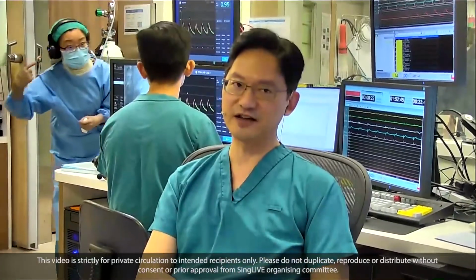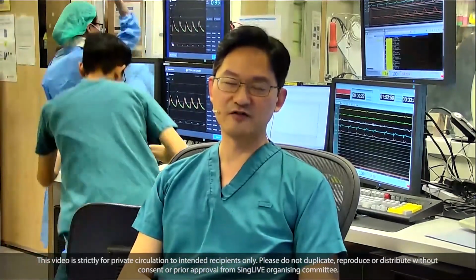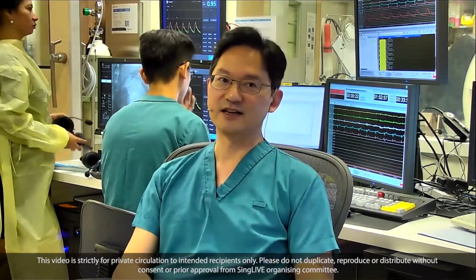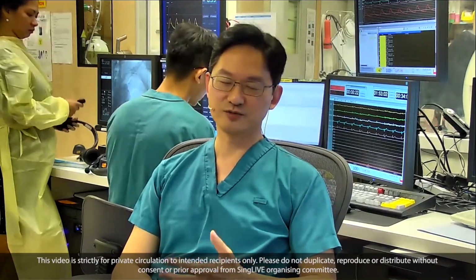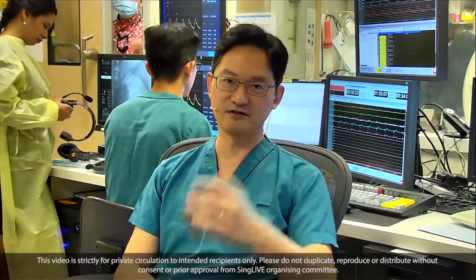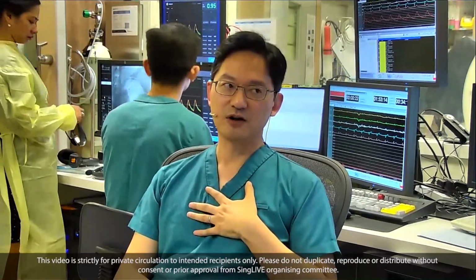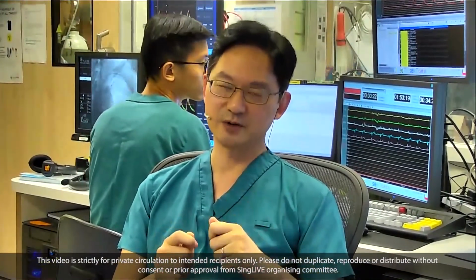But if I'm going to make a forward-looking statement, it is perfectly possible that you might be operating somewhere in, say, Kuala Lumpur, and your patient is not very well in a regional hospital with a cath lab, but not a very experienced operator, somewhere like 500 miles away. You could actually operate on that patient, and I would think that using the robot, I can probably do a slightly marginally better job than a very inexperienced operator.